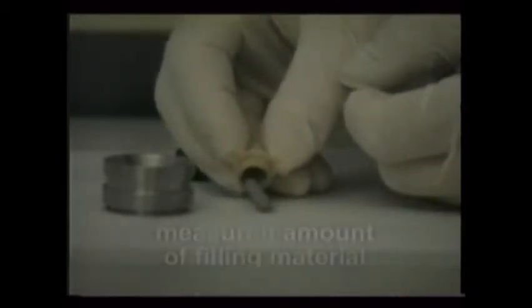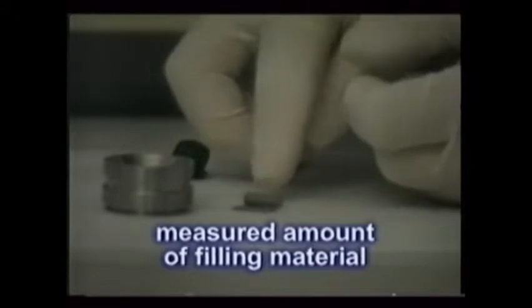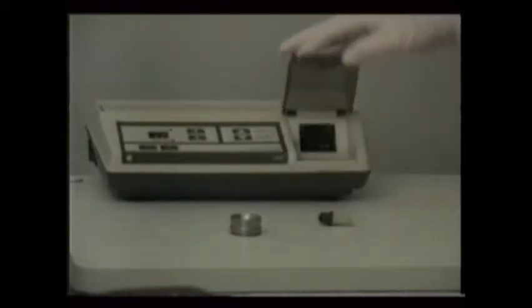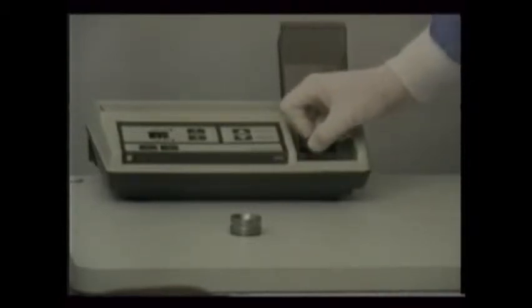The amalgam capsule contains the filling material. It replaces the need to mix free mercury and amalgam powder together by hand. The capsule has a measured amount of filling material within it depending on its external color, and it also contains a mixing pellet. The mercury is not released inside until the pellet breaks it loose during mixing. When placed in the amalgamator, the pellet combines the materials and begins the amalgam's setting process.